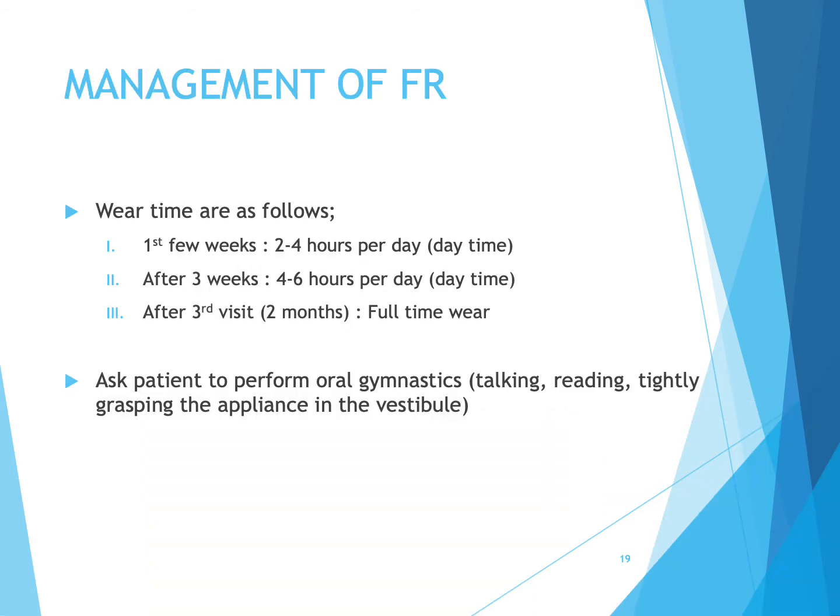Management of FR. The wear times are as follows. We can ask the patient to wear the functional regulators 2 to 4 hours per day for the first few weeks. After 3 weeks, we can ask the patient to wear the FR for about 4 to 6 hours per day. And after the third visit, which is around 2 months, we can ask the patient to start wearing the FR full time. The patient is also asked to perform oral gymnastics, for example, talking, reading, and tightly grasping the appliance in the vestibule.